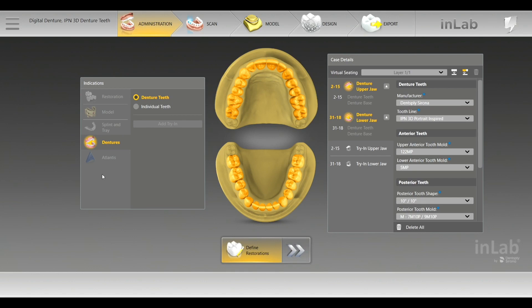Right now with the digital setup, you are able to have both balanced and lingualized occlusal setups already predetermined. There are currently 14 anterior and 12 posterior molds. For the digital world, that fits approximately 80% of all patients.